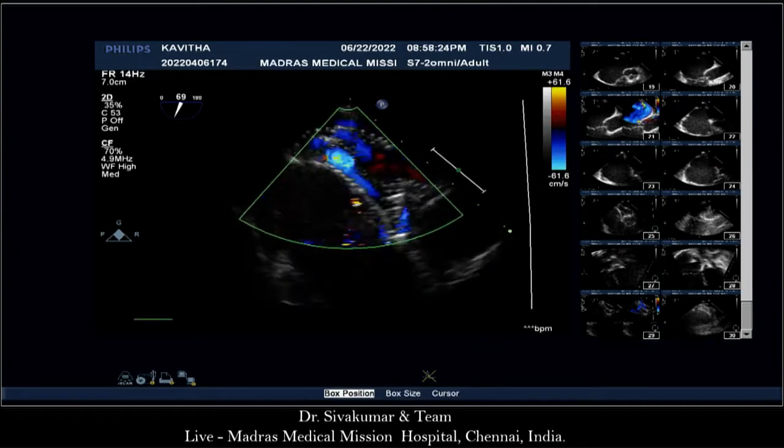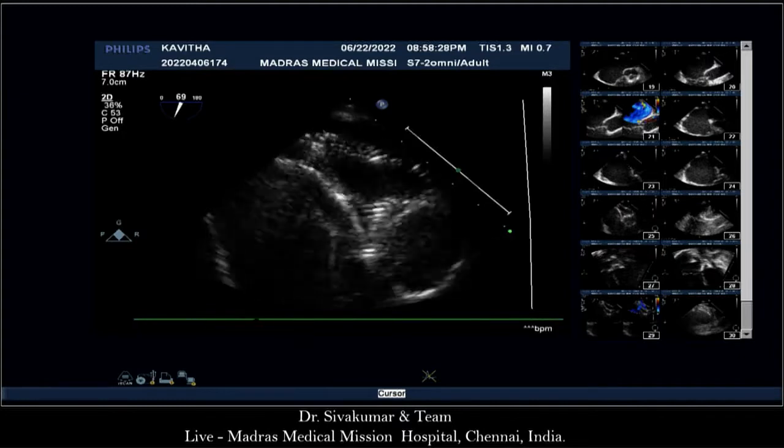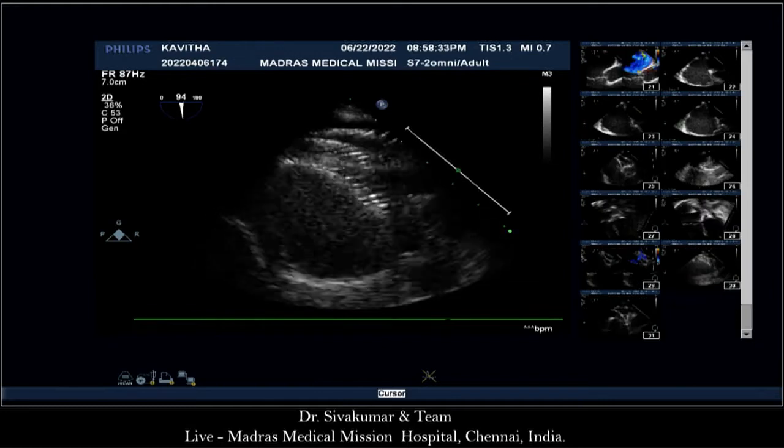Color out and show the margin now between the two. To me, it looks better. The device got shrunk because it was lying in water for some time.